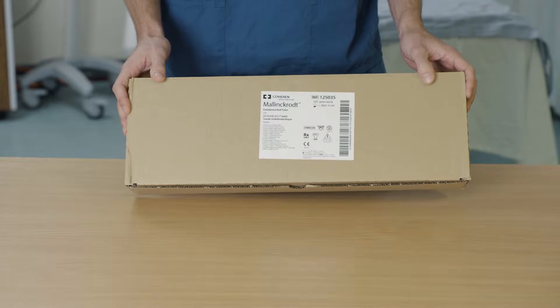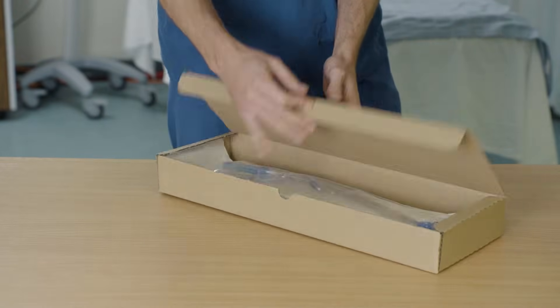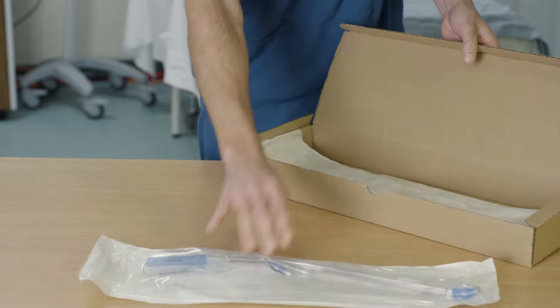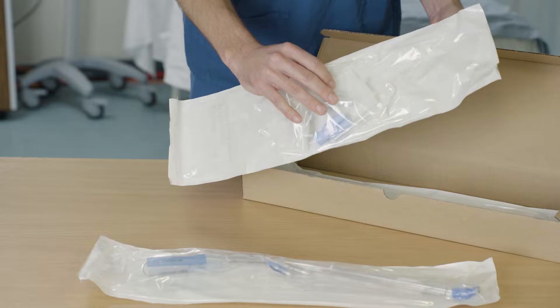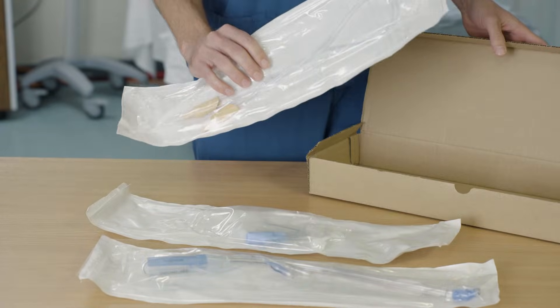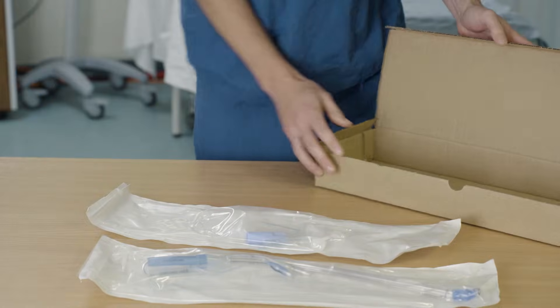A double lumen tube can be found in a box that looks like this. If we open it up, you'll find the double lumen tube, some connectors, and some suction catheters. We'll put these to one side for now — we don't need those at the moment.